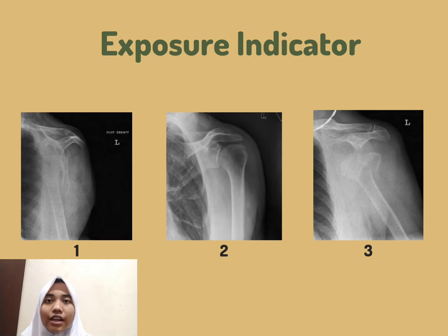This results in an X-ray image that looks overly white or light compared to a properly exposed radiograph. An overexposure usually means the X-ray beam was too powerful and that a larger percentage of X-ray passed through the patient's tissues to reach the film or plate.